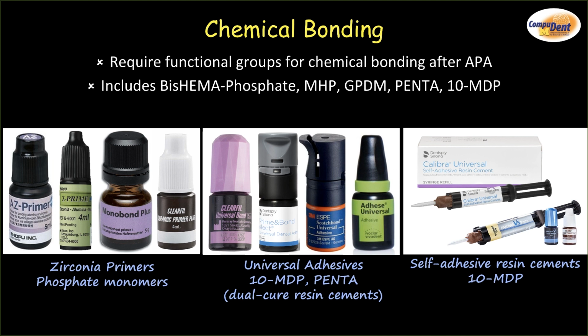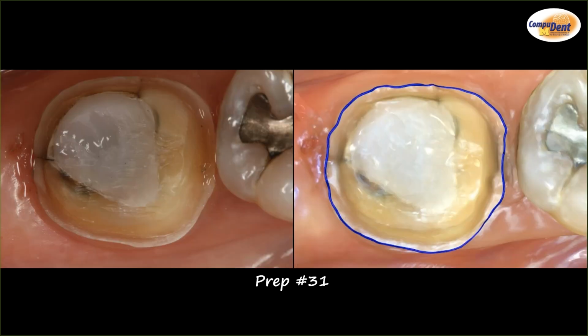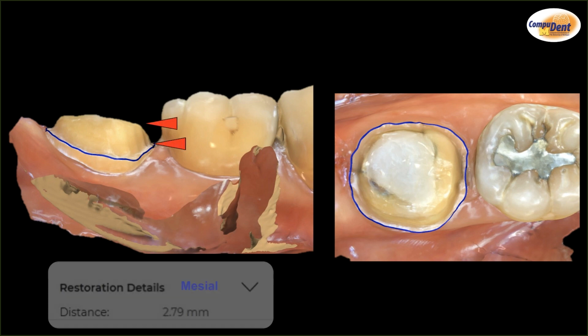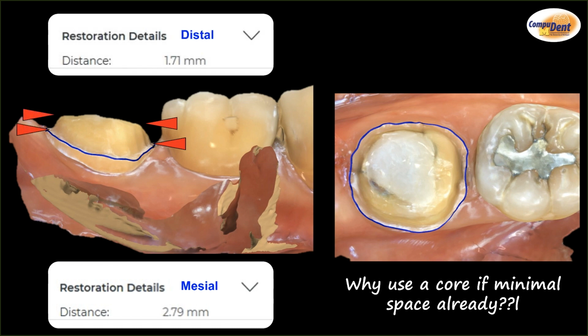So let's look a little further into this. Here's a situation. Here's another one of our second molars, short clinical crown situations. And there's the preparation. It looks pretty good on its surface. Taper doesn't look too bad. Looks like we got a fair amount of tooth. There's been some sort of a block out or a core material there, obviously. So here it is again, and let's look at it in profile. You can see we're on the short side. We probably don't even have to measure it, but it doesn't look too bad. Visually it looks shorter than what it measured out to be. So the question is then, what about the distal? And that's where we have a problem.